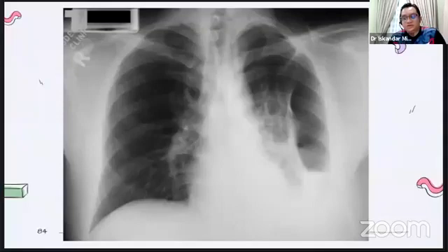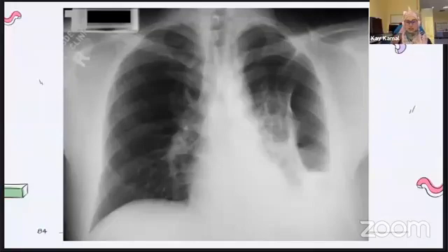So we go to our audience on Zoom. Hi doctor, my question is, what are we looking for in the lateral view of chest X-ray? Just so you know, I don't use the lateral view chest X-ray. As I remember during my 4 years of training, and now in total 6.5 years of doing radiology, we don't use lateral as much anymore, or almost none. Myself, I have never read or even suggested a lateral chest X-ray, because number one, it's really hard to read, because when you have a frontal chest X-ray, you already have many interfaces, from the skin all the way to the spine.